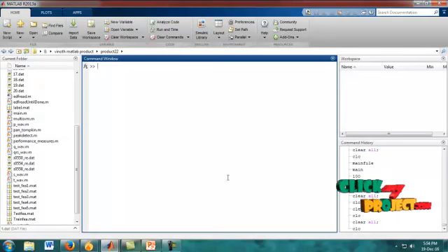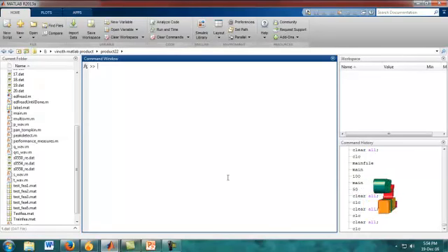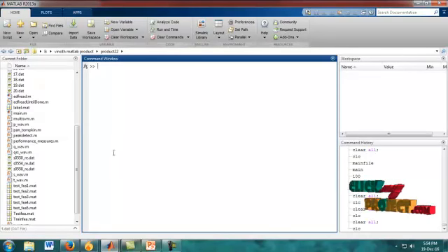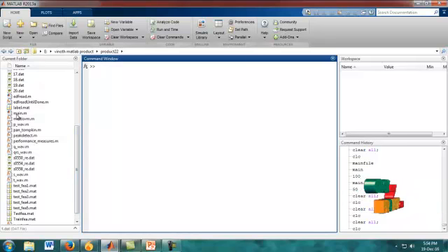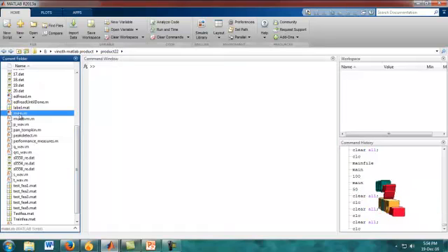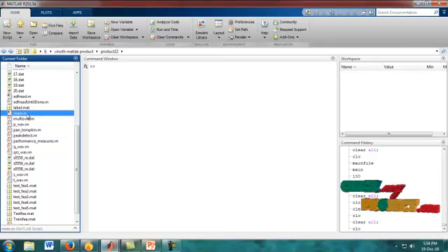Finally, we measure the performance analysis for the detected waves. The project source code file is run from the command window. In the current folder, there are many files and we choose main.m, which is our source code file.